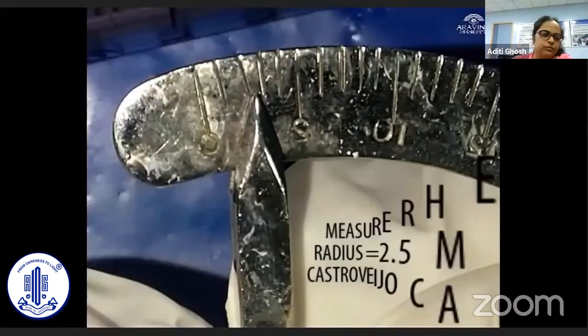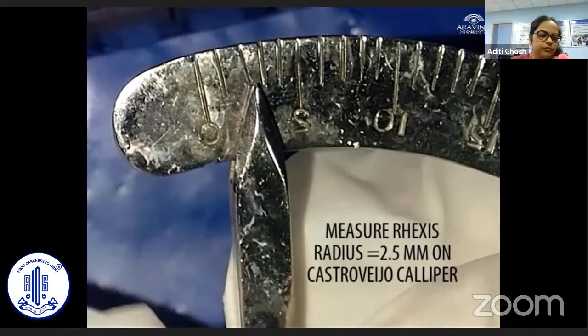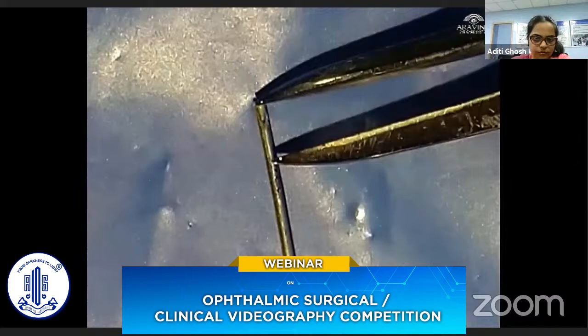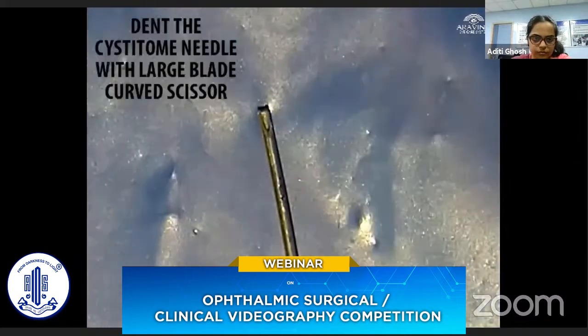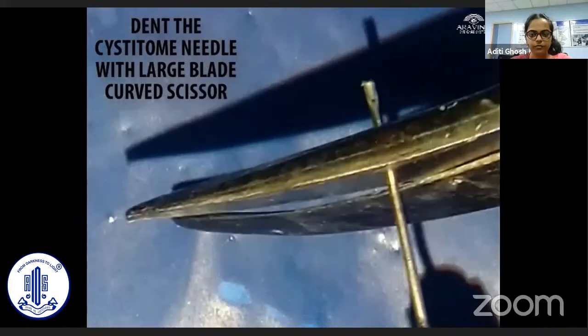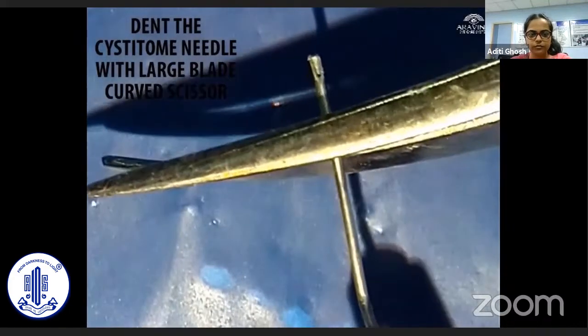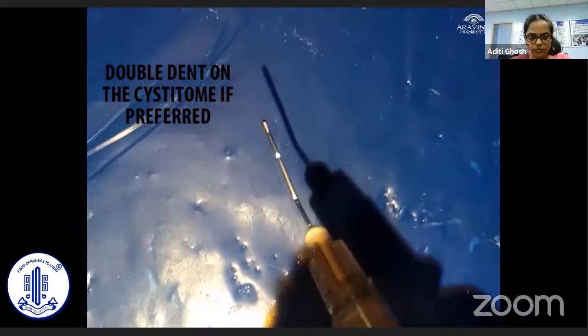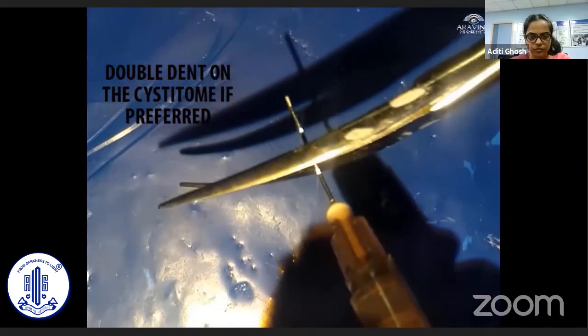For phacoemulsification, set the caliper at the required rhexis radius of 2.5 mm and mark the distance from the tip of the cystitome. Press on the marked distance uniformly using a curved tenotomy scissor to make the dent. Optionally, a second dent can also be made at a uniform distance from the first dent to mark the rhexis diameter.